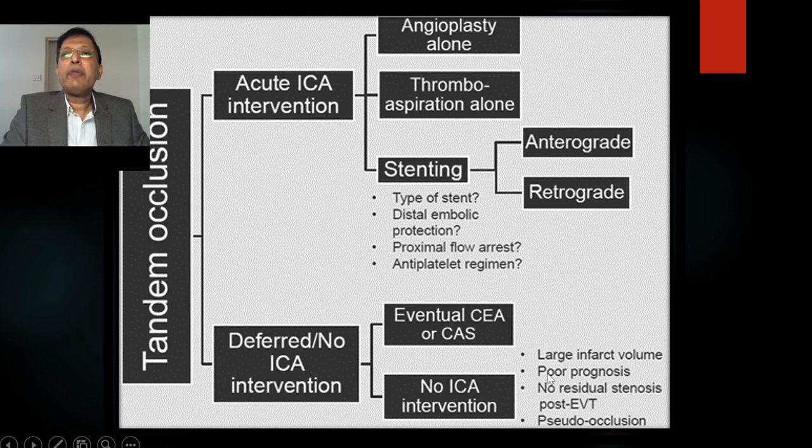In situations like when the patient has a very large infarct, the outcome is going to be poor. At the end of the procedure, you keep the guiding catheter in the internal carotid artery for a long period of time, and there is a significant expansion of the carotid stenosis, and there is no significant residual stenosis. And last but not the least is the pseudo-occlusion which I discussed, where it is actually not a true occlusion but a collapsed vessel because of a distal occlusion.